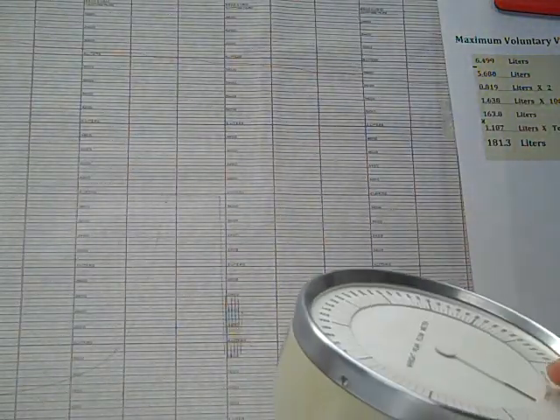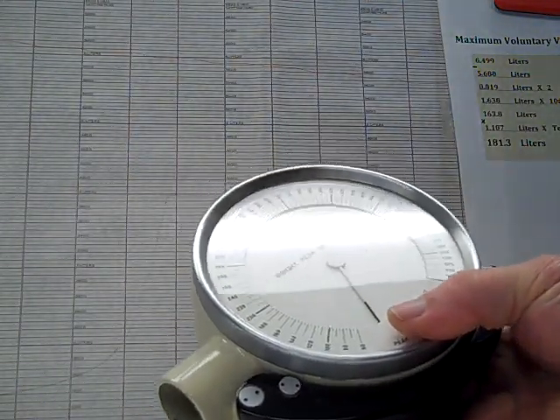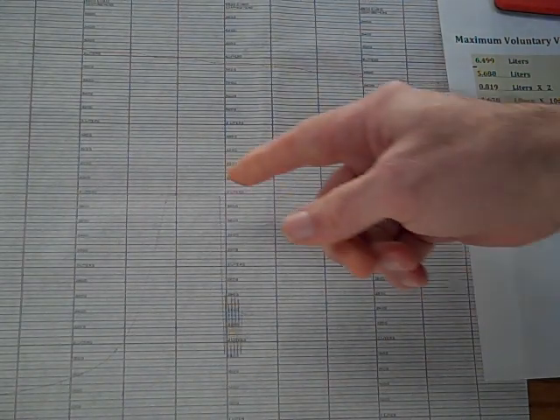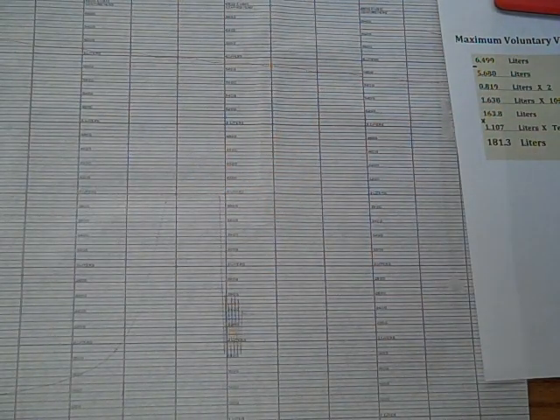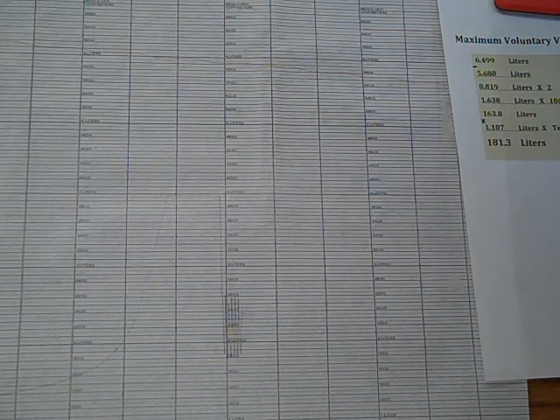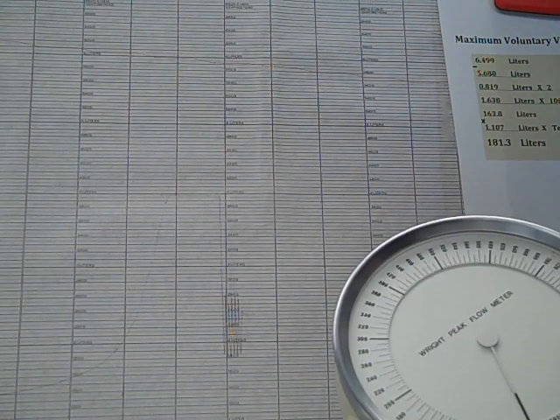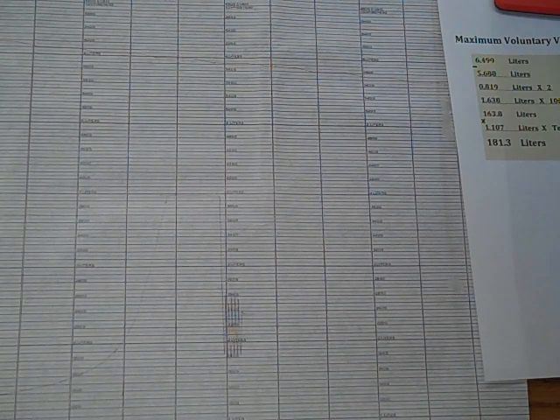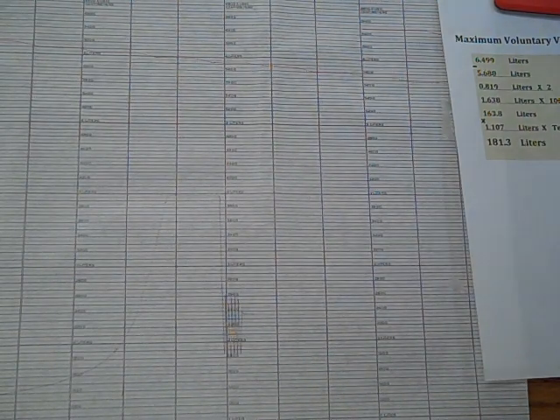One thing that we do have an improvement is often today we can use a peak flow meter to measure the peak flows, because the FEF 200, 1200 test that we used to use back then, the numbers are significantly lower, and with advances in technology, we're able to use, let's say, a Wright's peak flow meter and get that number also. So I hope you enjoyed this presentation.